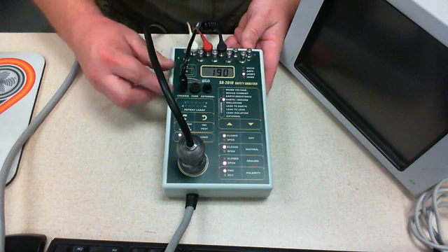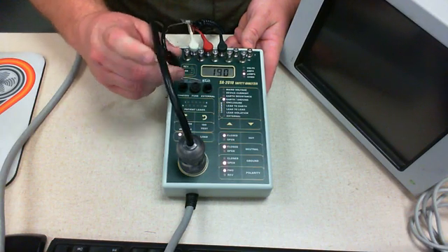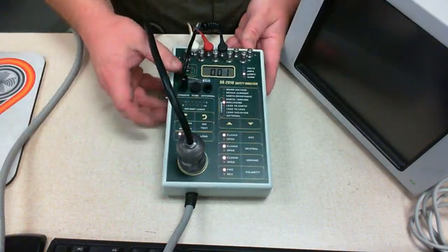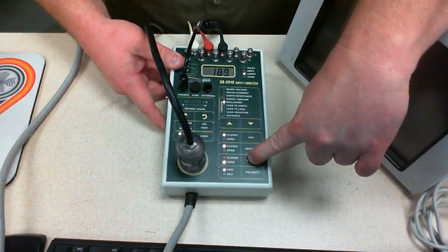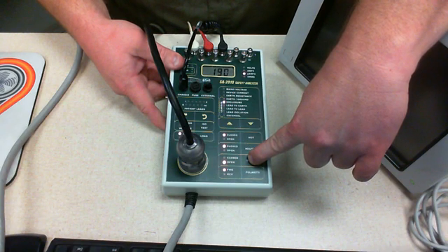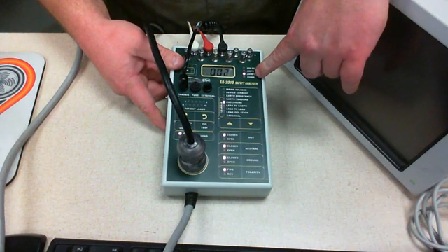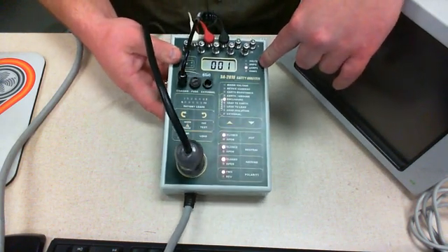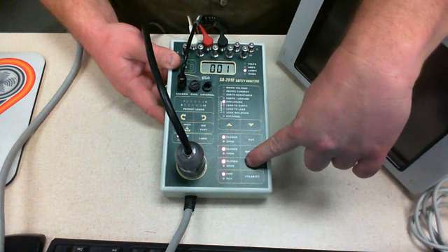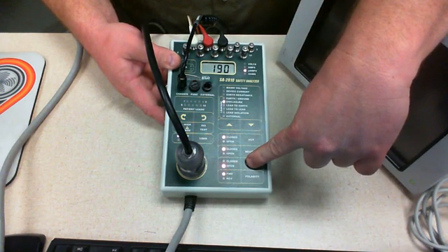This is our earth leakage. Notice this is not using my Calvin cable because I just disconnected it. What I want to use is the chassis leakage — this is the one where we open the ground and it gives us a measurement. Notice how high the chassis leakage is: it's giving 300 microamps. Holding it down, I've got 190 microamps. This is characteristic of these Space Labs monitors — they really do have a high amount of leakage current from the power supply, due to the type of power supply they use.